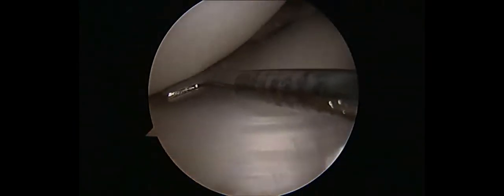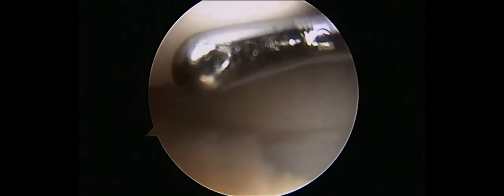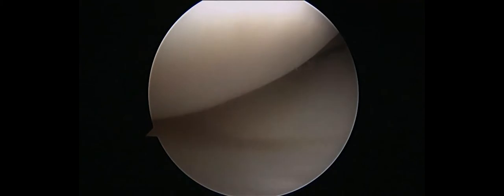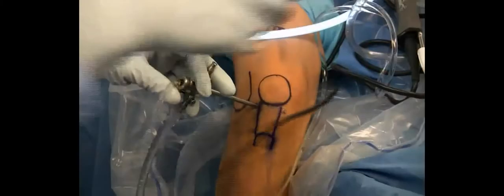We then bring an arthroscopic probe into the joint and carefully assess the articular cartilage. While we examine the articular cartilage, we make sure that there are no unstable cartilage flaps, delaminations, or obvious instability of the OCD lesion.